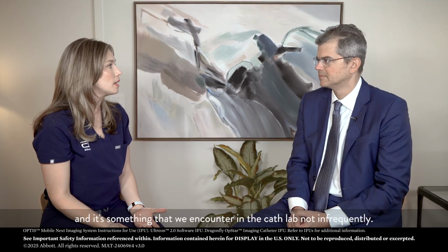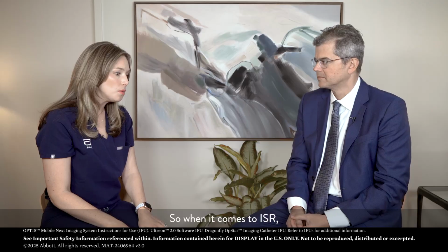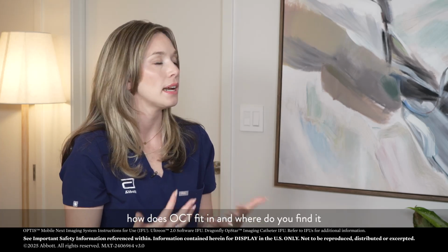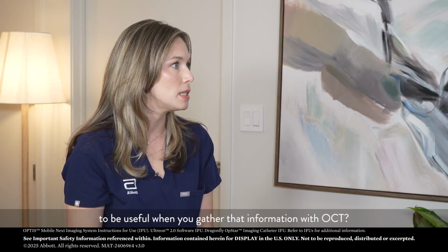Dr. Bezerra, ISR is a hot topic right now, and it's something that we encounter in the cath lab not infrequently. Would you agree, about 10% of interventions? So when it comes to ISR, how does OCT fit in, and where do you find it to be useful when you gather that information with OCT?